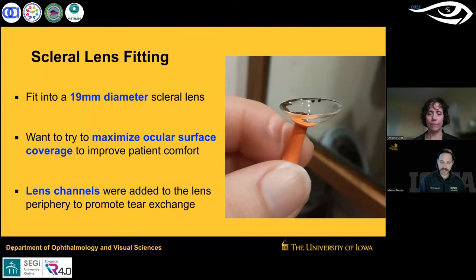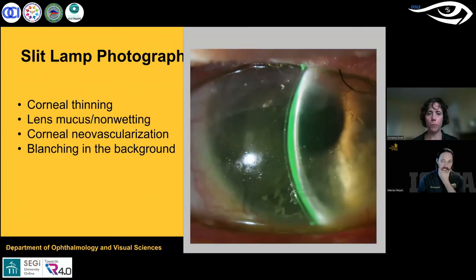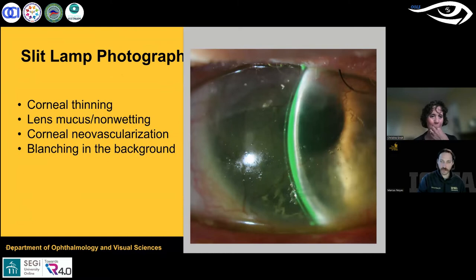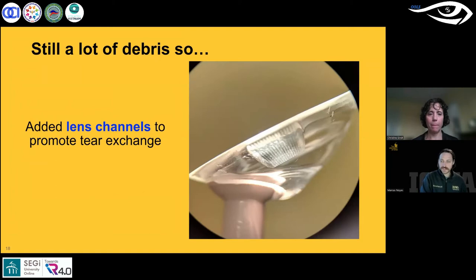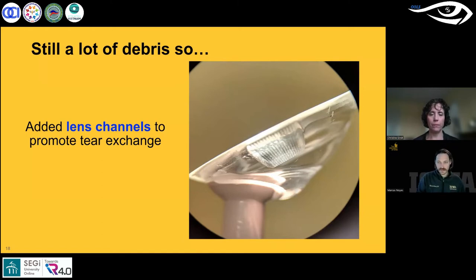Here's the slit lamp photograph showing corneal thinning, mucus, non-wetting, and corneal neovascularization. This is a zoomed-in picture of the lens channels — little gradations on the underside of the lens — thought to help tear exchange. With ocular surface disease patients, you want as much tear exchange as possible to ensure oxygen and nutrients reach the eye.